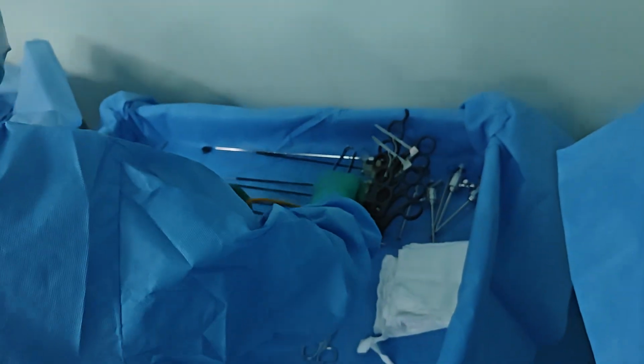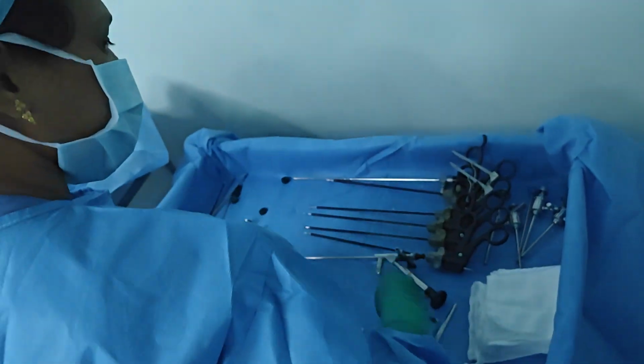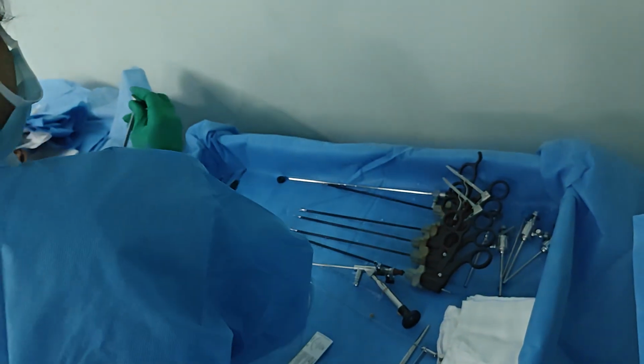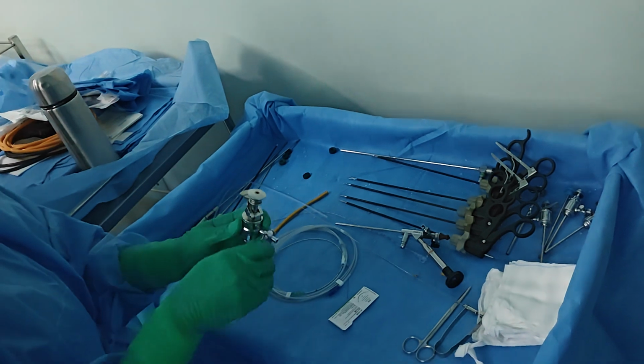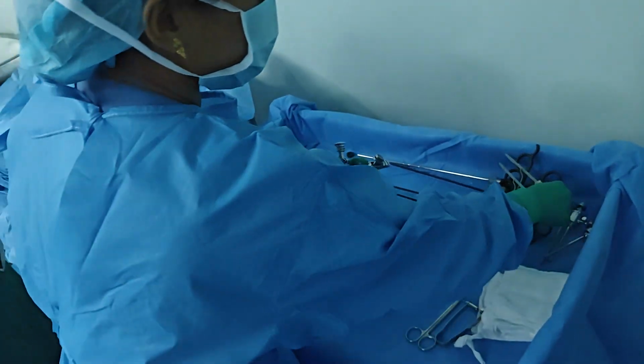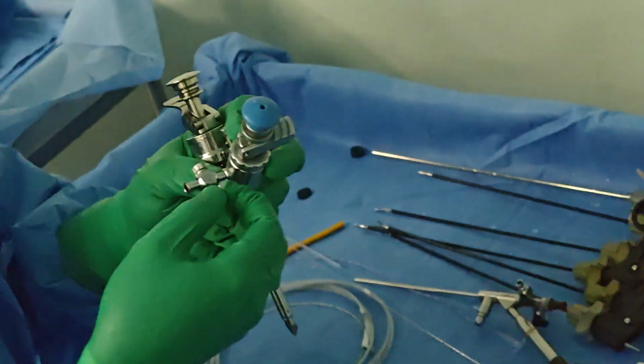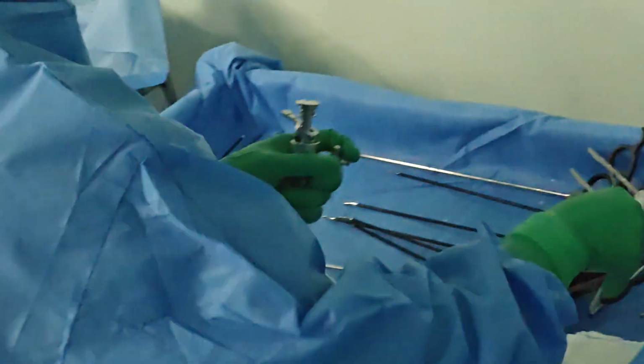So we have the 5 mm telescope, right? Yes, sir. And then the 5 mm trocar. Can you show the 5 mm trocar? That is the 5 mm trocar we have. And we have a 3 mm, that is a 3 mm trocar, proper for assisting instruments. Okay, show me the instruments.